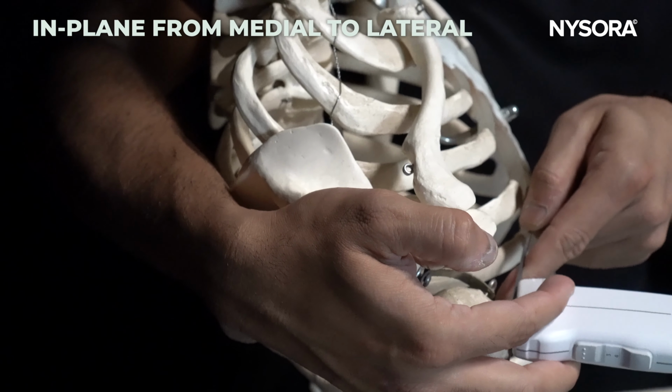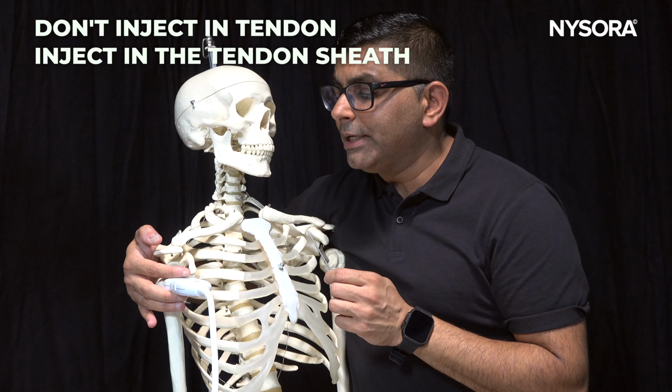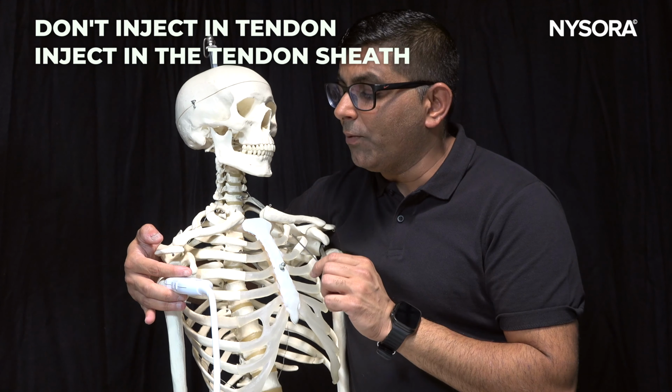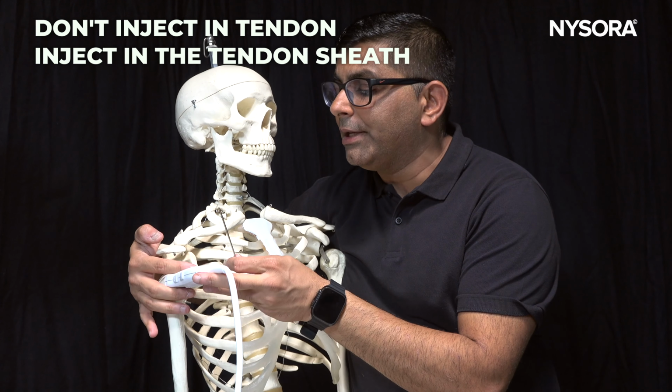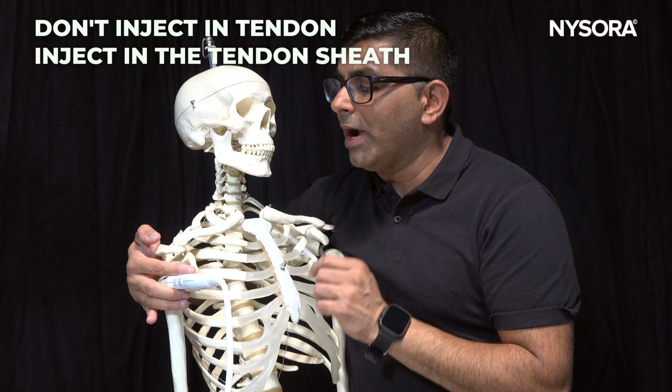so to perform the injection, I prefer doing it in plane, coming from medial to lateral, and don't inject the local anesthetic and steroid in the tendon. It's basically for the tendon sheath rather than the tendon. Injecting the local anesthetic and steroid in the tendon will lead to rupture of the tendon, so only inject it around the tendon.